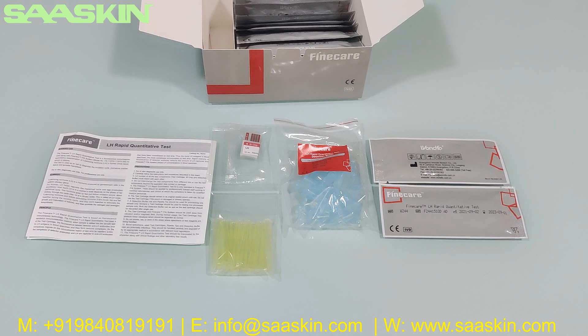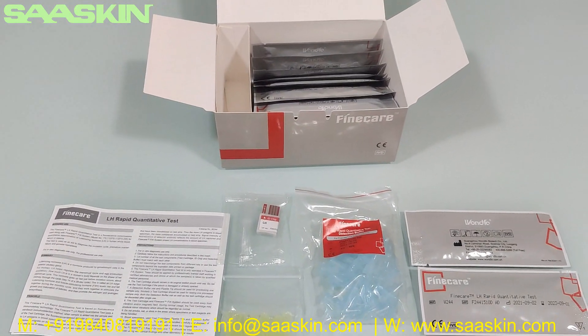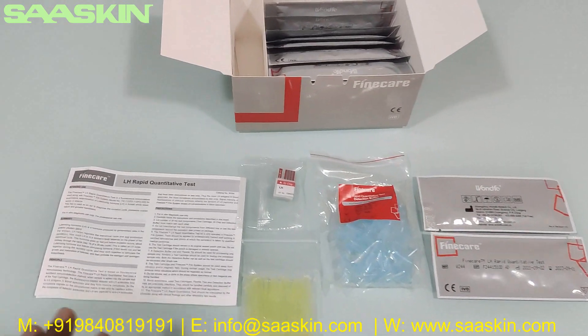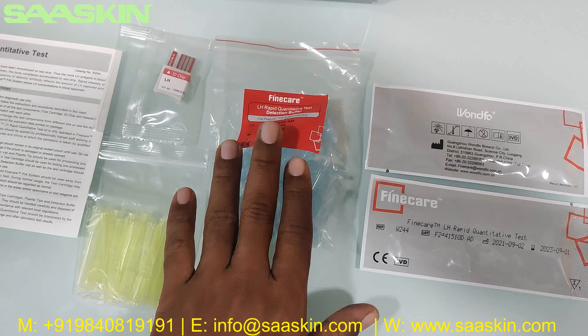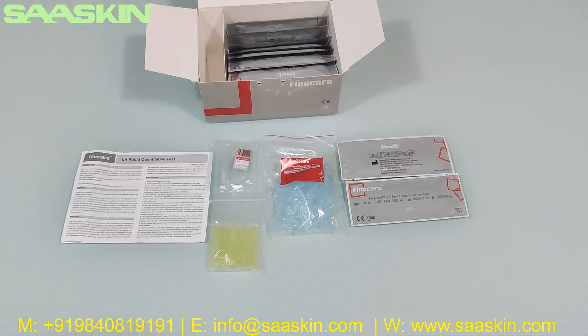So quickly to summarize: today we are seeing the unboxing of the Wunfo Fine Care LH Rabbit quantitative test in a 25 test kit pack. You get one instruction-for-use brochure, one ID chip, 25 pipette tips, 25 individual dilution buffers, and 25 test cassettes. This is how the complete test kit looks.